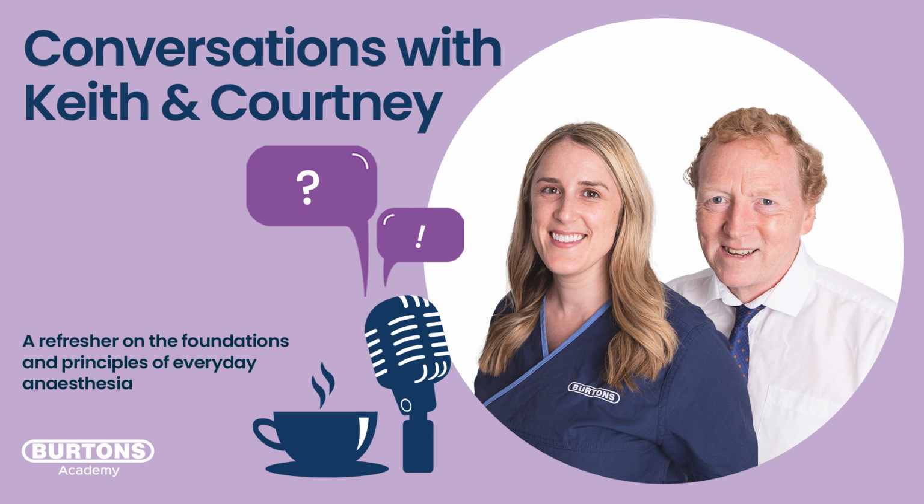Whether you remember Boyle's law or not, that's just what happens. If the thing can't expand, the pressure will have to go up. And so it will go up a lot more rapidly and to a higher degree than it would with the little puppy lungs. So the puppy's got elastic, very compliant lungs is the wrong word. Let me use the word thorax, okay? And then the Westie's got a very non-compliant, stiff thorax. So the two behave differently.